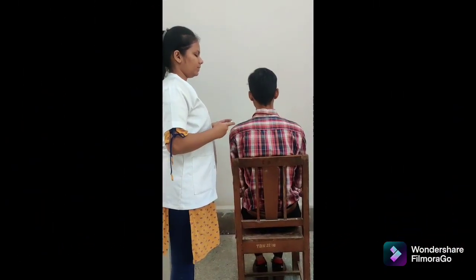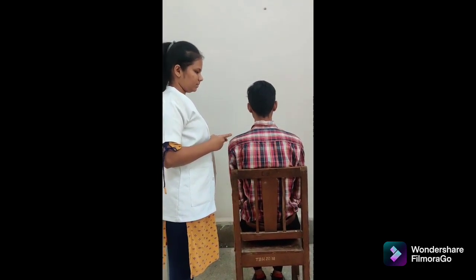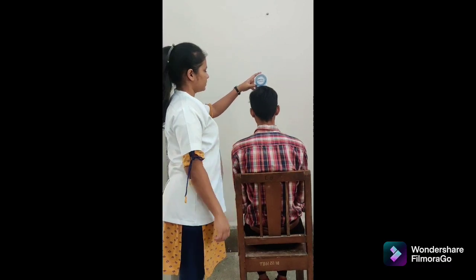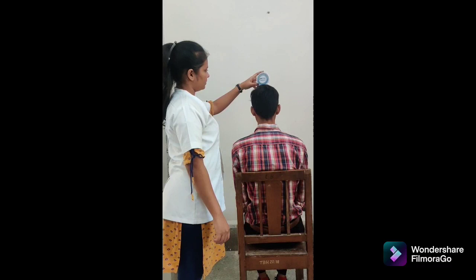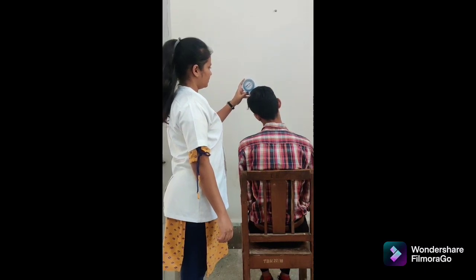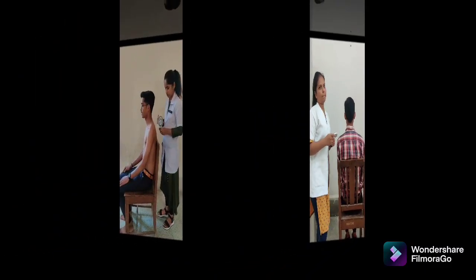We are going to perform cervical lateral flexion with inclinometer. Patient position: high seating with thoracic and lumbar spine supported by back of chair. Inclinometer alignment: place the inclinometer firmly on the top of the subject's head, adjusted to 0 degrees. Instruction: move the head into lateral flexion while keeping the trunk straight. At the end of range of motion, read and record the degrees indicated by the fluid in the inclinometer.